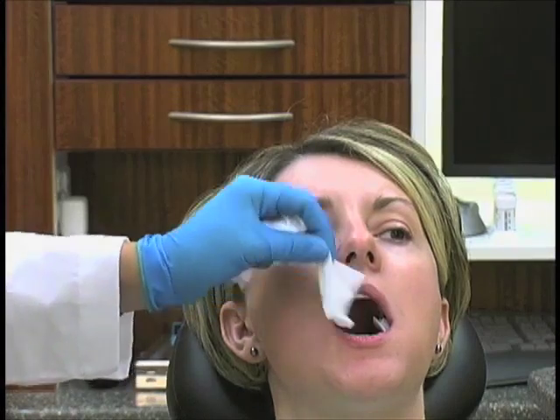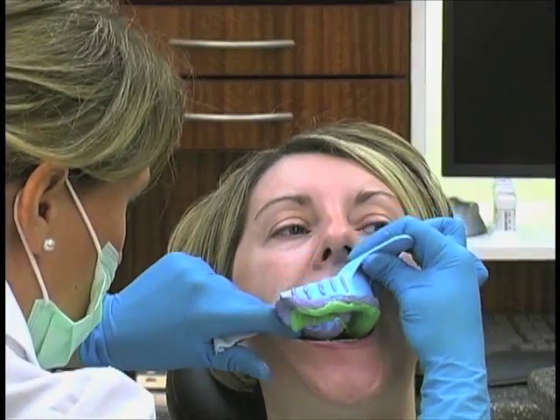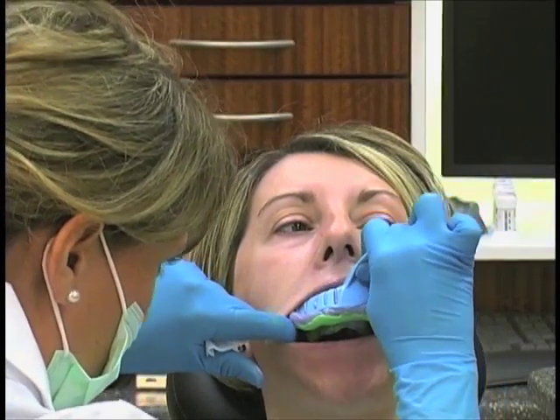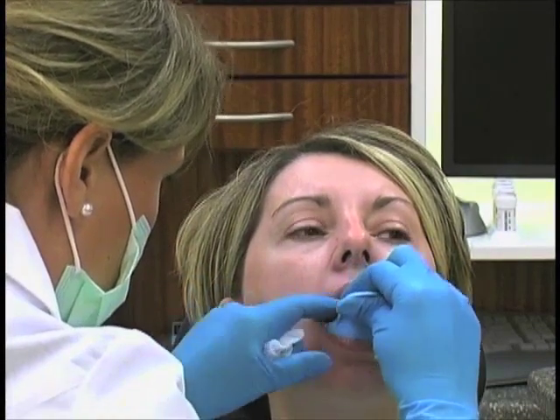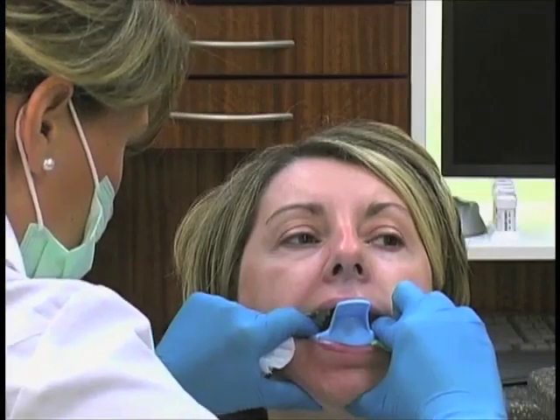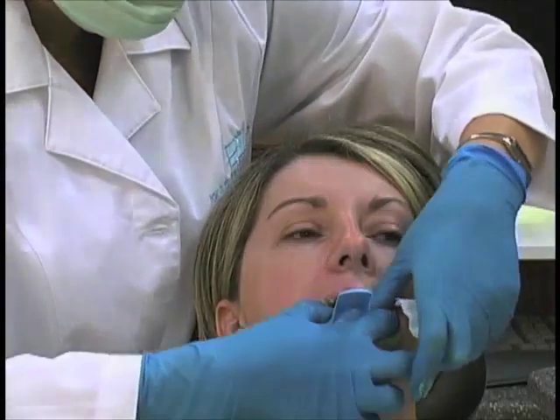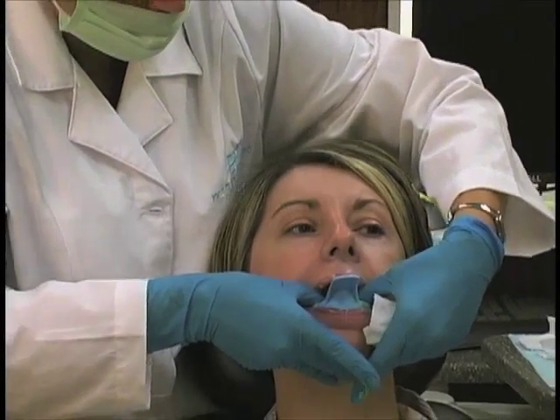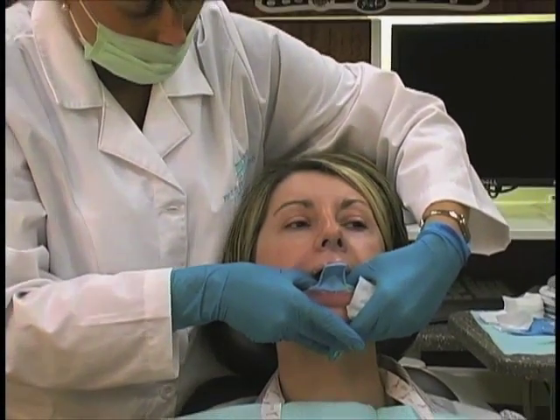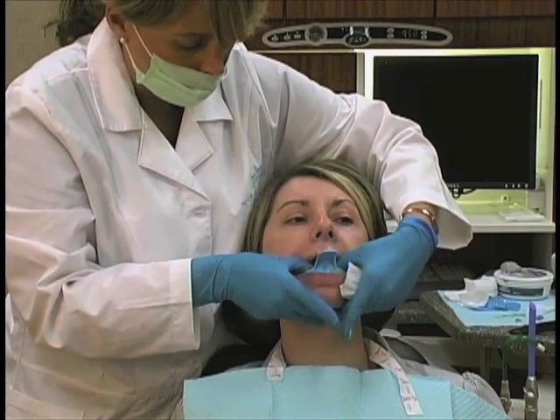And when this goes in, this is what's slick, is that the putty and the wash is even going to displace the tissues even a little bit further. You get some hydrostatic pressure going on the teeth. And all this sets up at one time. So this process is going to take maybe 3 or 4 minutes, but what I think you'll find is it leads to unbelievably detailed, accurate diagnostic impressions.